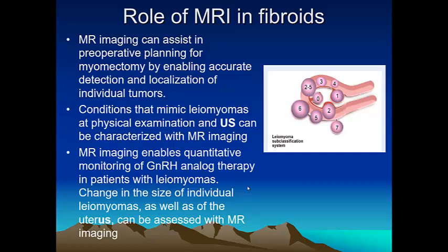We have more indications nowadays: pre-interventional treatment, pre-embolization, pre-HIFU, and pre-radiofrequency ablation. We can do MRI for assessment before, and then follow up after the treatment.